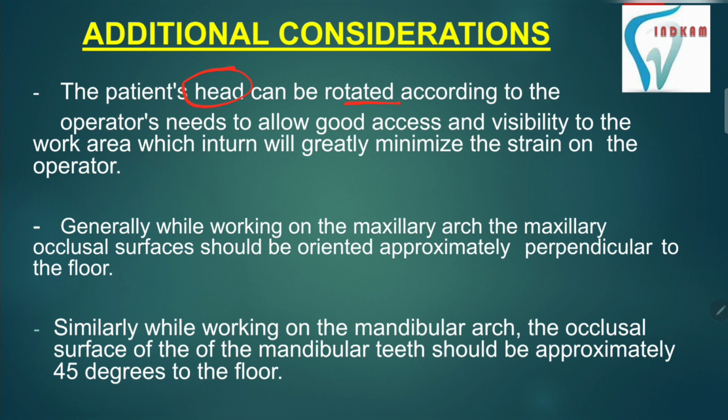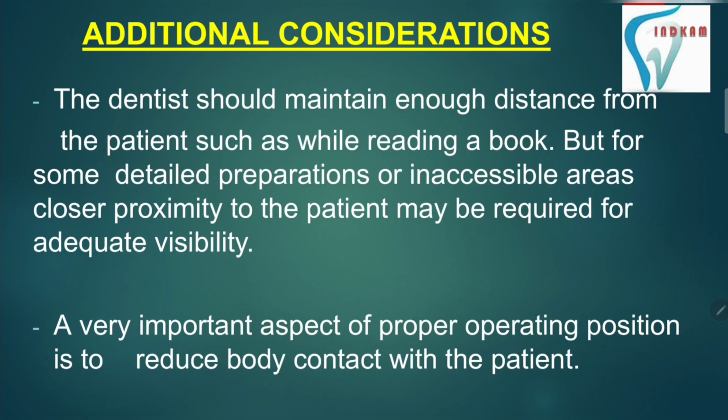The second one is generally while working on the maxillary arch, the maxillary occlusal surfaces should be oriented approximately perpendicular to the floor. Similarly, while working on the mandibular arch, the occlusal surface of the mandibular teeth should be approximately 45 degrees to the floor. The dentist should maintain enough distance from the patient, such as while reading a book, but for some detailed preparations or inaccessible areas, closer proximity to the patient may be required for adequate visibility.